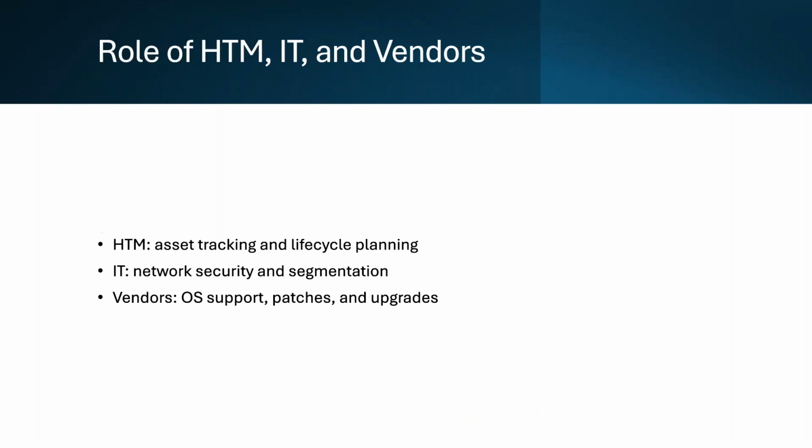So what's our role in all of this? HTM teams are central to managing embedded operating system risks. We track assets, maintain device inventories, plan maintenance schedules, and implement lifecycle strategies. You know which devices are most critical, which are most vulnerable, and which are approaching end of life.